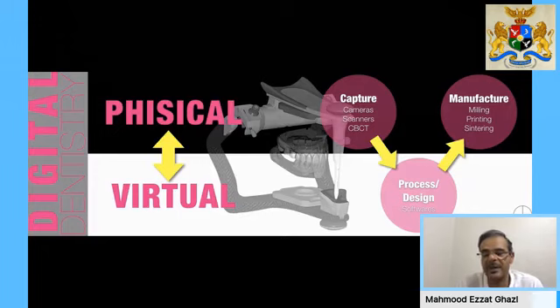With digital dentistry, just imagine instead of having your patient in front of you on the chair, you actually have your patient on your laptop or on your computer screen in all layers that you can imagine, having the CBCT looking at the bone and the teeth and the roots, having the intraoral scan where you can see the gums and the crowns, and having, let's say, a photo or a facial scan of the patient where you can see the face and you can see the skin.